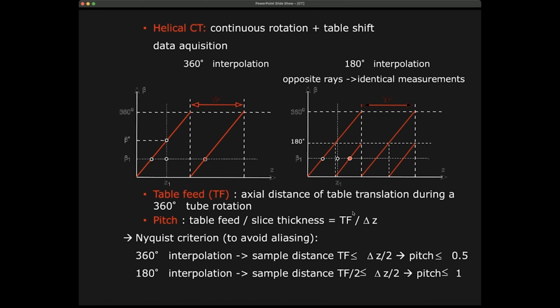So this made the scanning more efficient, and faster. In principle, you can do a lower dose. And you can then do a cost-benefit analysis: how fast do I want to scan compared to the number of projections that we have, the number of degrees of projection, whether we do a 180 or 360 degree scan, and what is the resolution that we would in the end reach?